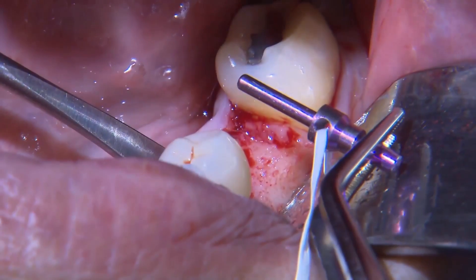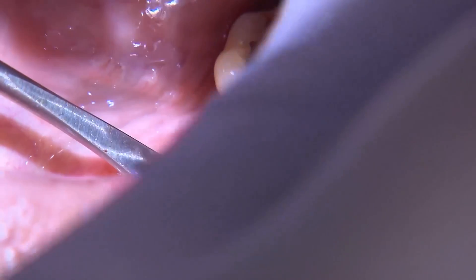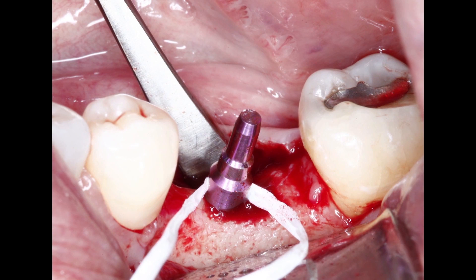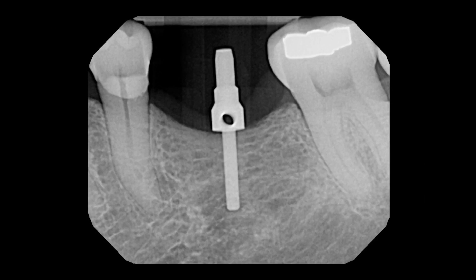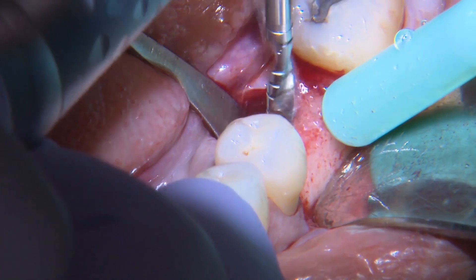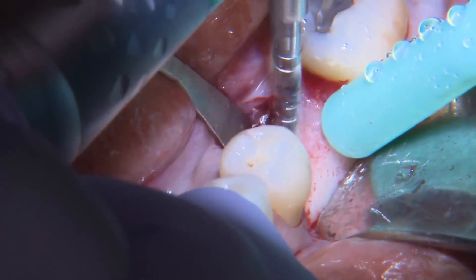What's really important when I'm placing the implant is to check with a parallel pin to make sure that my osteotomy is in the right direction. As you can see here, I might be tilted a little bit to the distal or the mesial. One way to confirm that is to take a radiograph to make sure that I'm away from vital structures and not tilted in an undesired direction.